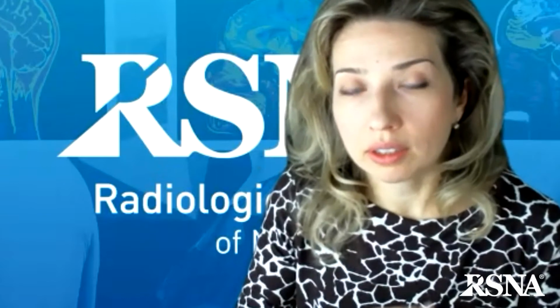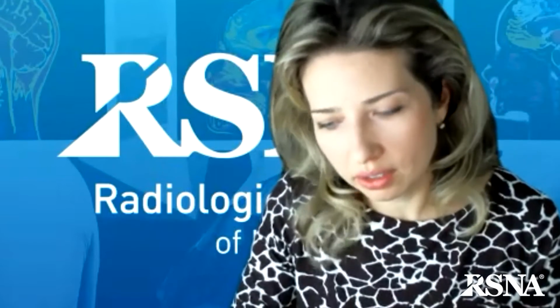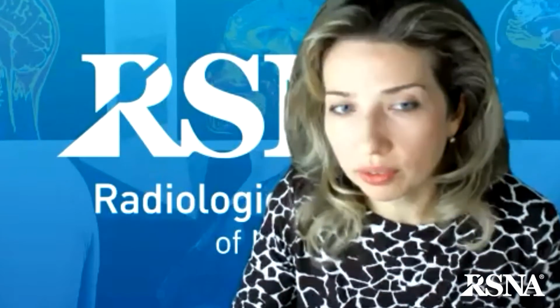So these are general principles of optimizing MRI in any body part. But for the flexor tendon injuries we're talking about, it is also important to consider the potential extent of injury and the information you need for surgical planning.